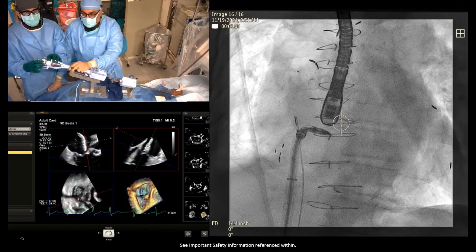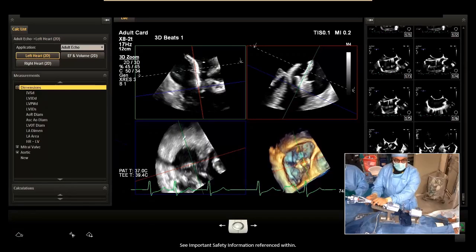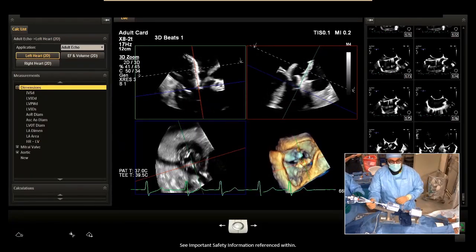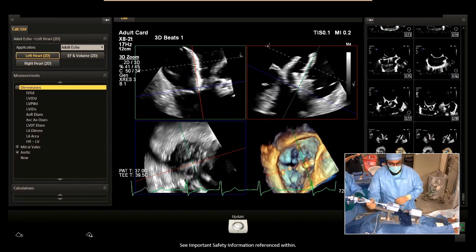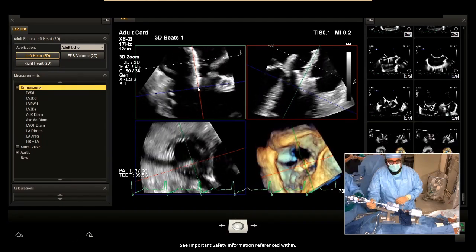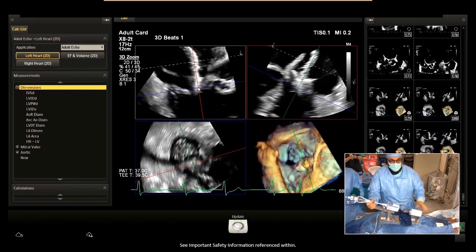Okay, opening clip arms. Good. I think that's a good place to start here. And real quick, since we're here, we got a beautiful NPR. We're going to do a tactile marker check here. Okay, tactile's coming down. Tactile is anterior. Non-tactile is septal. Okay. So that looks really good here, Edris.